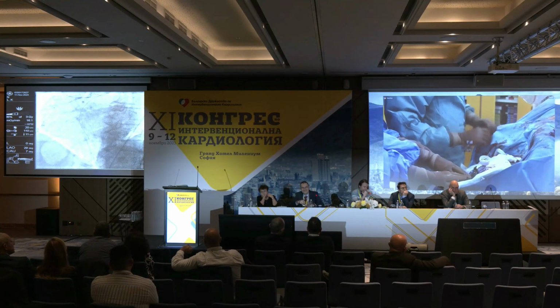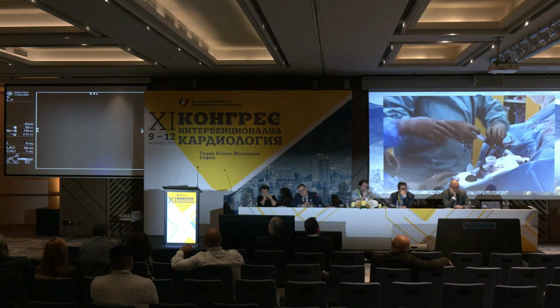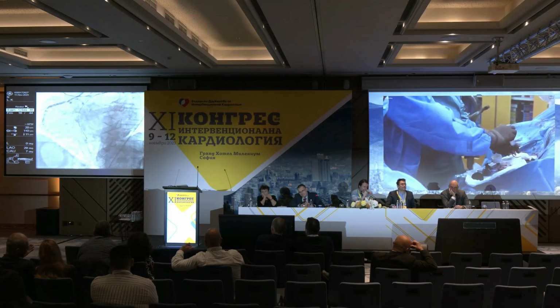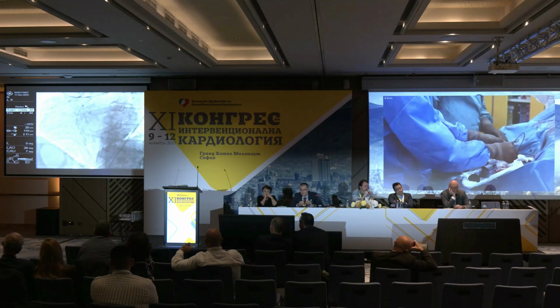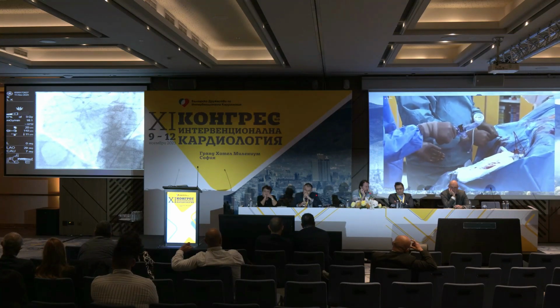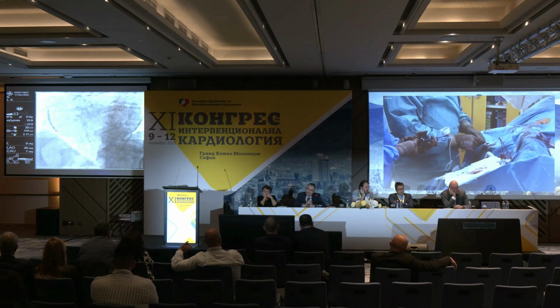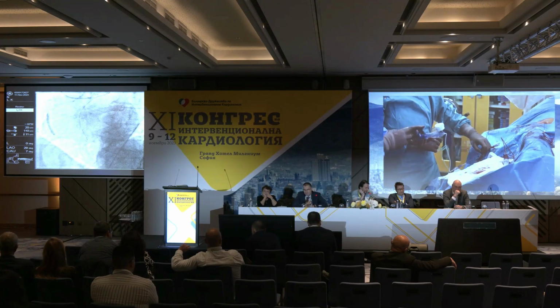Dr. Gelev, 20. Let's make a film just with the balloon there. Something like 28, might be longer, 24. You see the stent? Okay. So maybe you can do the same thing here with a run-through wire into the aortic level, to not miss the ostium with the wire, a safety wire in the aortic root. Yeah, we can do that, and we might need to do that.